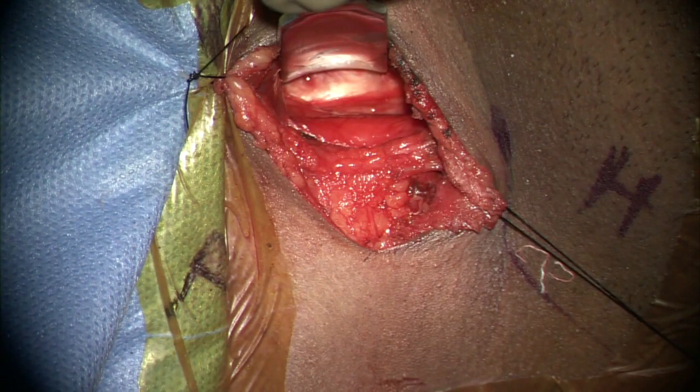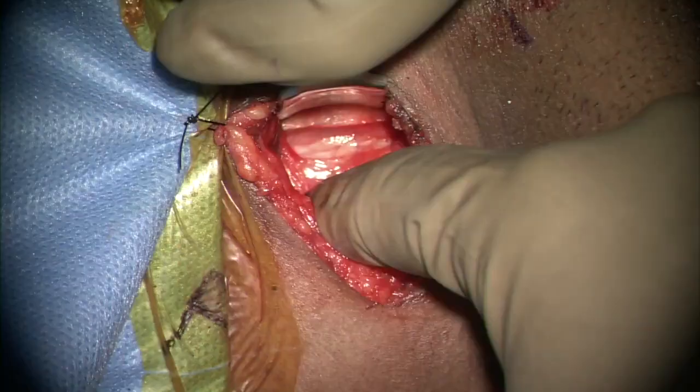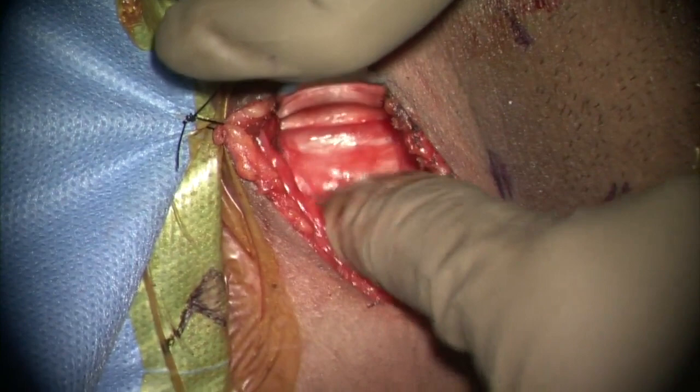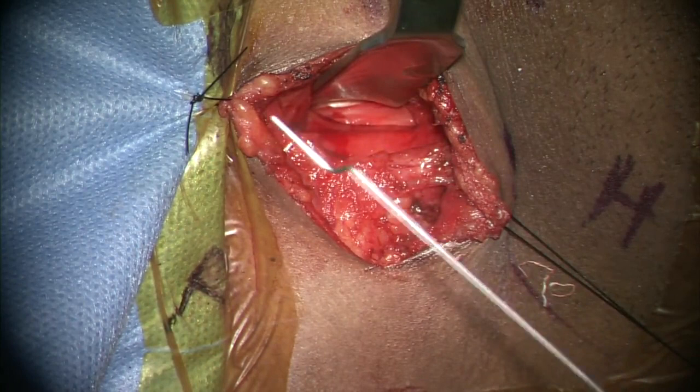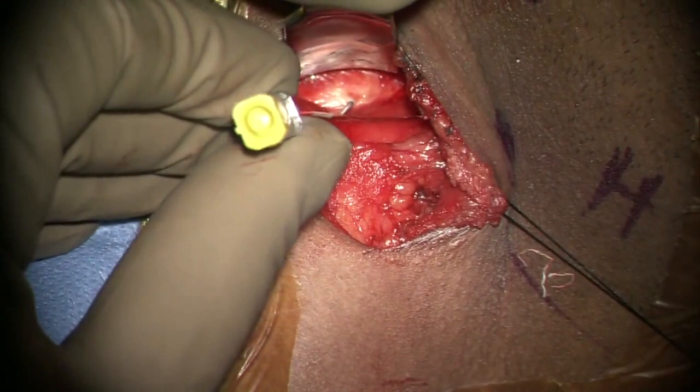The prevertebral fascia is dissected and the discs can be identified as small hills and the vertebral bodies as valleys. A Cloward retractor is used to retract the visceral structures medially. The trick is to expose an additional level so that the tension on the viscera is minimal, which prevents post-op dysphagia.